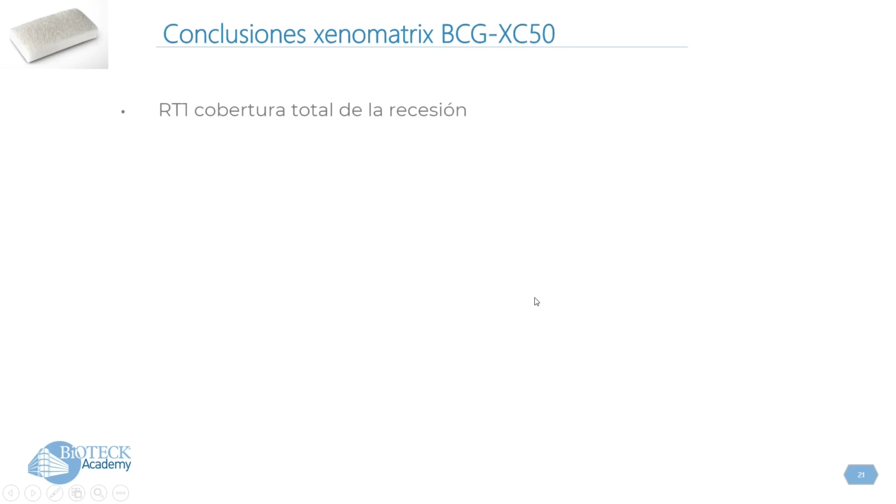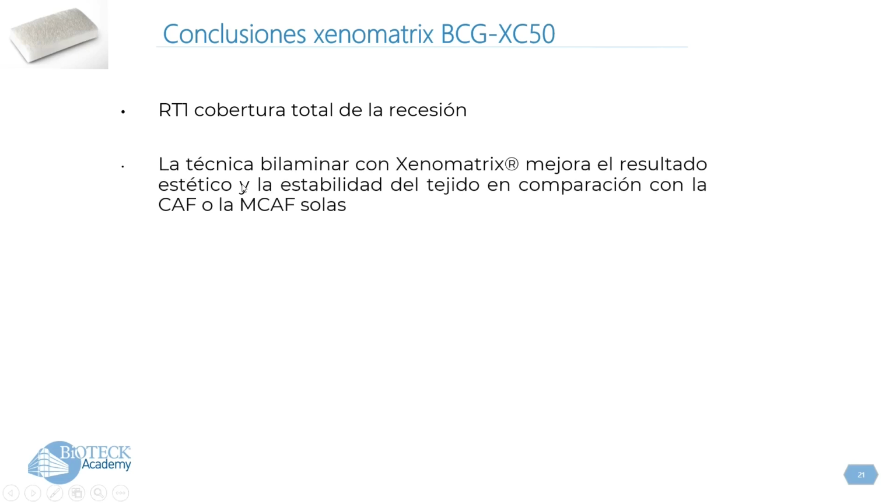So with BCG XC50 we can obtain the complete coverage of the recession of type RT1 that corresponds to the old class 1 and 2 of Miller. Using the bilaminar technique with the Xenomatrix improves the aesthetic results and also the stability of the tissues compared with the CAF or MCAF alone.